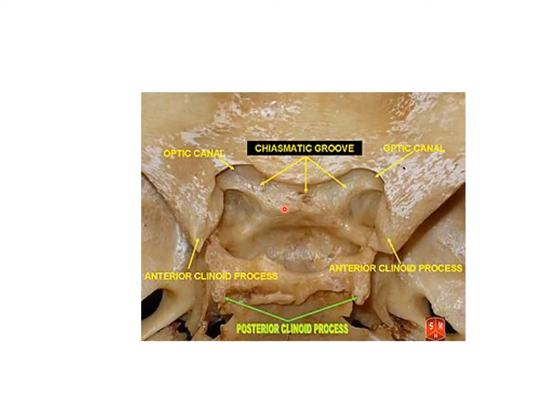This is a view of the hypophysial fossa. Here you can see the optic canal and the sulcus chiasmaticus where you get the optic chiasm. Then the end of the lesser wing gives the anterior clinoid process. Then the dorsum sellae with the posterior clinoid process and the tuberculum sellae. The tuberculum sellae, the hypophysial fossa, and the dorsum sellae together form the sella turcica, where you get the pituitary gland.